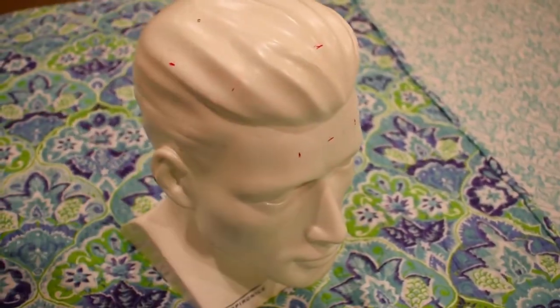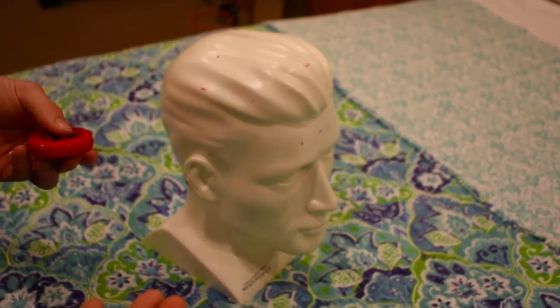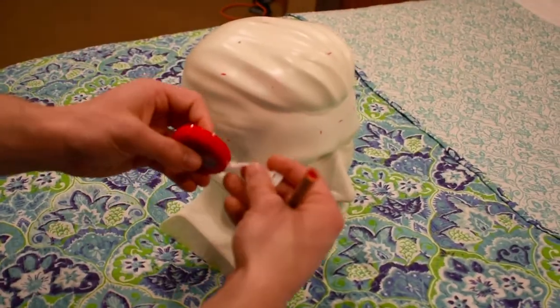And then the same thing for FP2, which is going to get us our marking for F8.